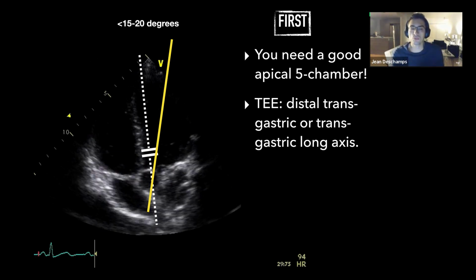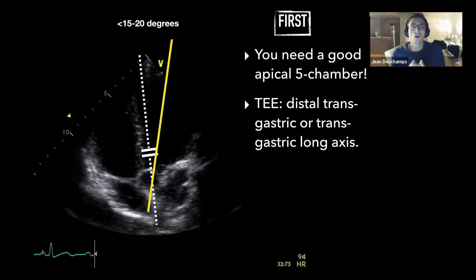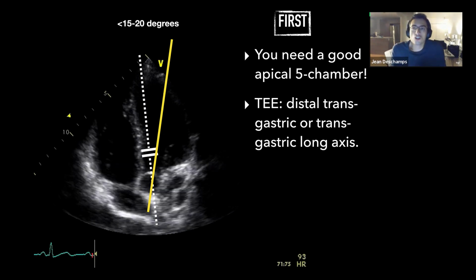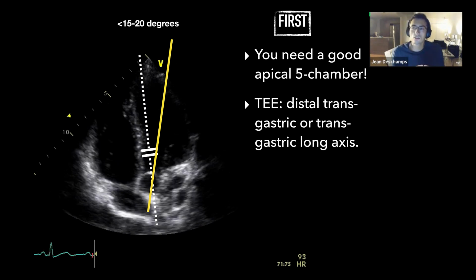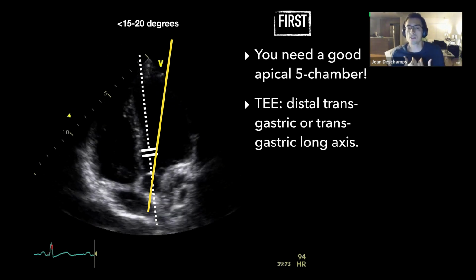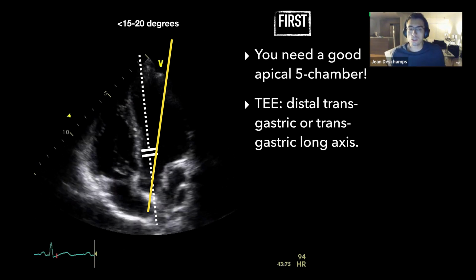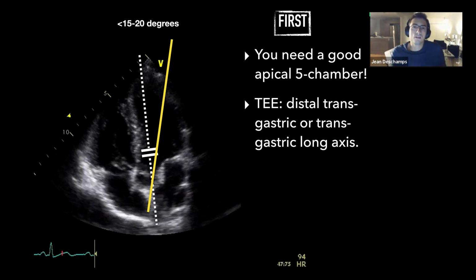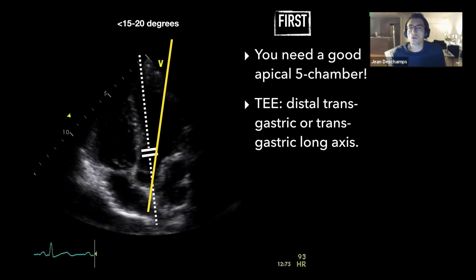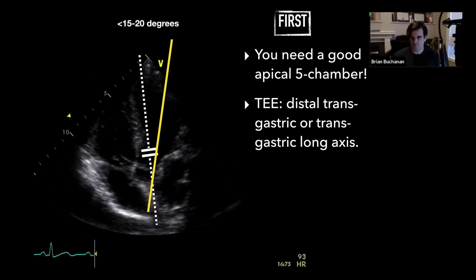Why don't we need as precise of a number? Because we are not qualifying whether a patient needs surgery or a valve replacement, which is the job of the echo lab. Our job is to estimate a gross cardiac output with VTI, which means that a precision of a couple hundred cc's or so is probably not the major thing in what we use it for.